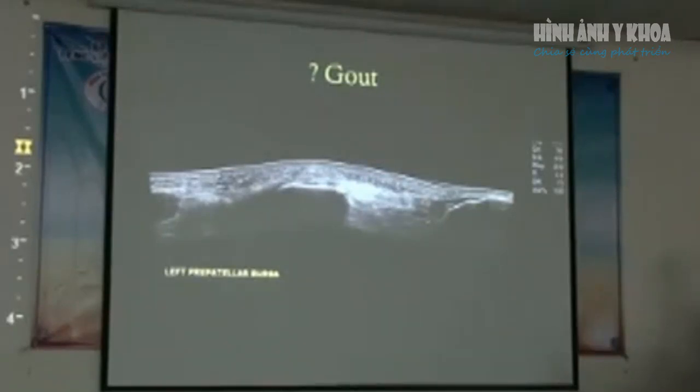But overnight he experienced extreme pain over the prepatellar bursa.